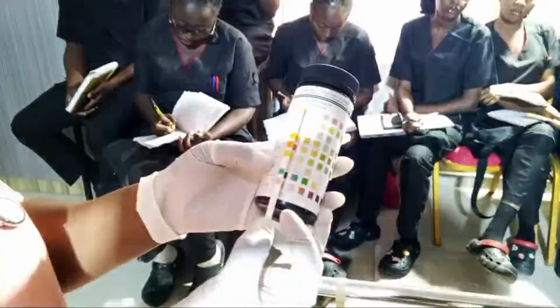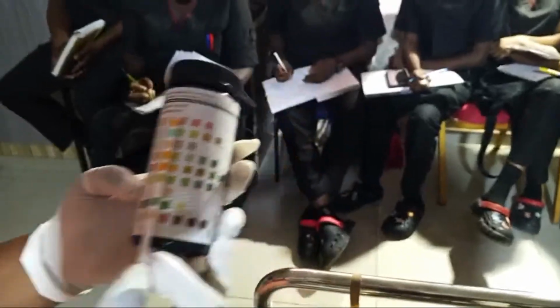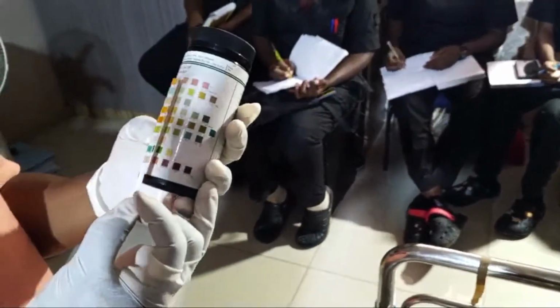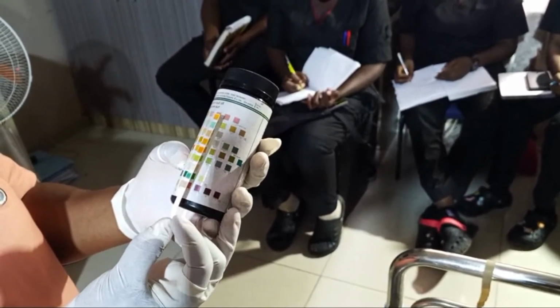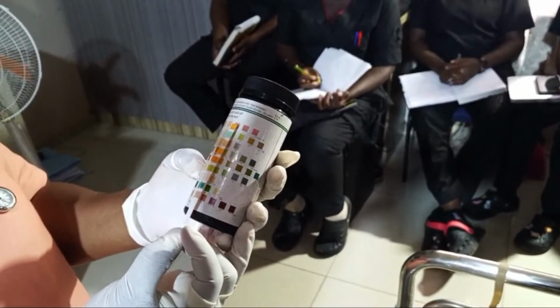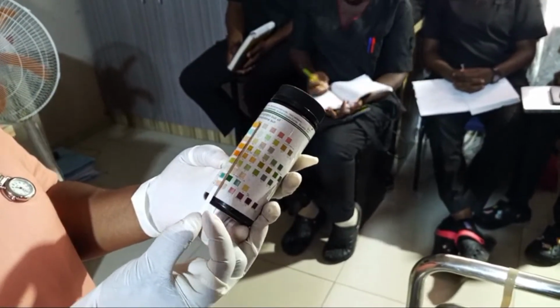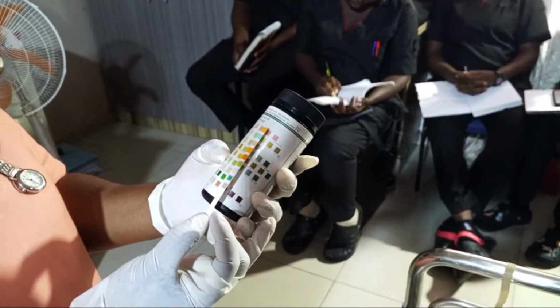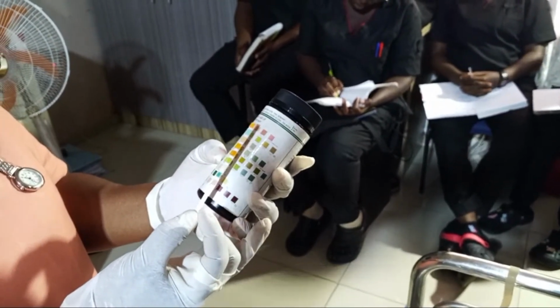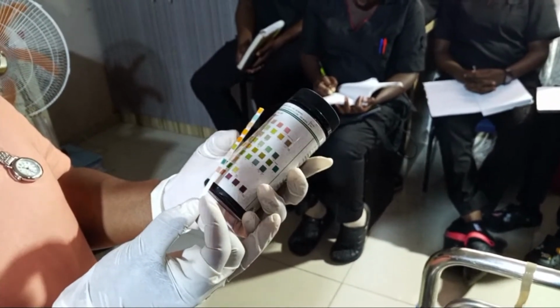Then we check for protein. Also, there is no protein in this urine. And then we check for ketones. For ketones, we have 0.6, of which it's normal, right?